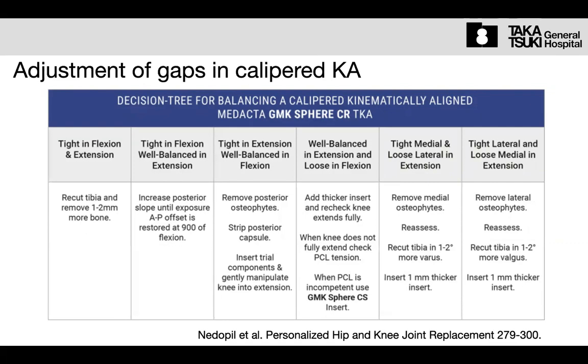In the mechanical alignment procedure, it's quite simple. Distal femur recut. Once we recut the femur, we can easily increase the extension gap, just like Oxford knee. Yes, but in kinematic alignment, we never recut the femur because we don't want to change the femur side articular surface.